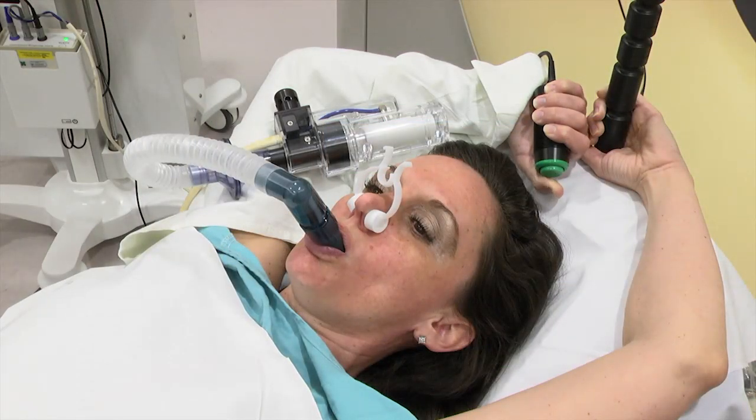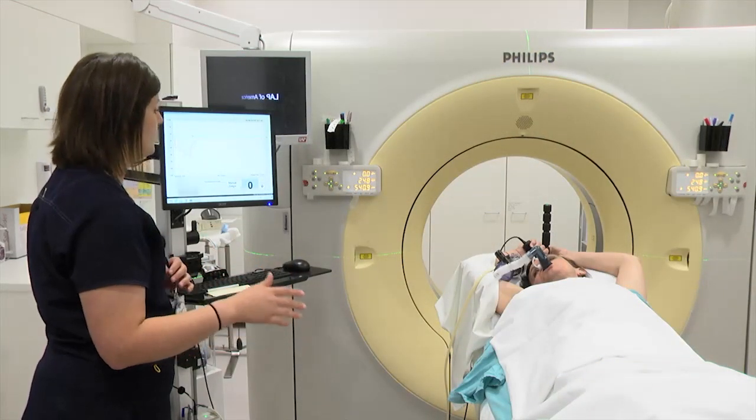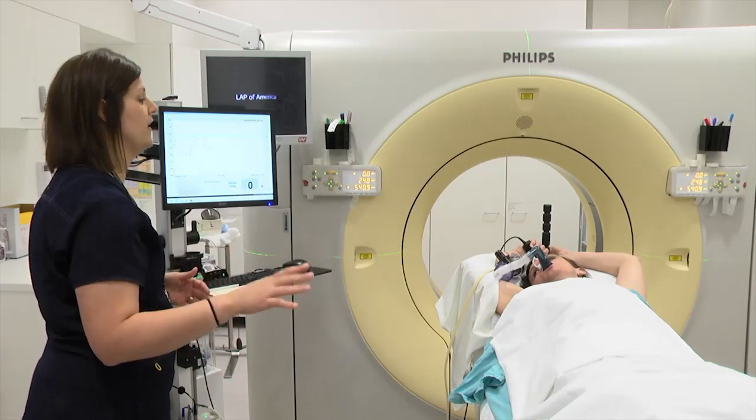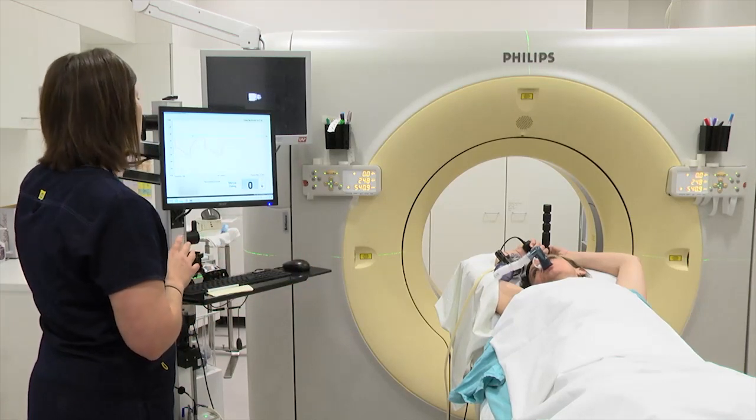If you need to breathe at any time, let go of the green button. You will also follow this procedure during each radiation treatment. Your therapist will let you know approximately how many times you will have to hold your breath during the treatment.